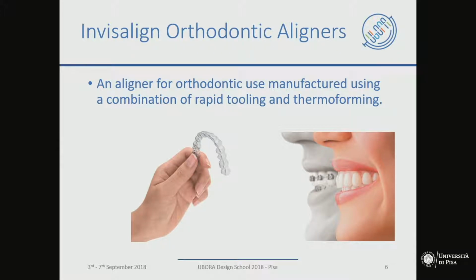Guys, I am not able to focus on you after the second line, so raise your hands if you say yes. Okay. This is not a 3D printed object. But it was built based on thermoforming on a 3D printed mold. Okay?